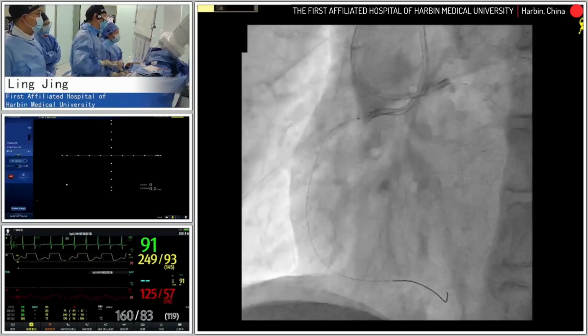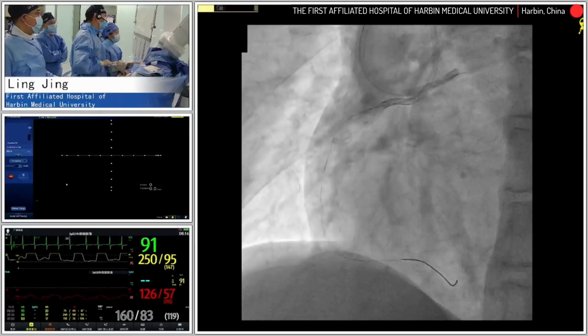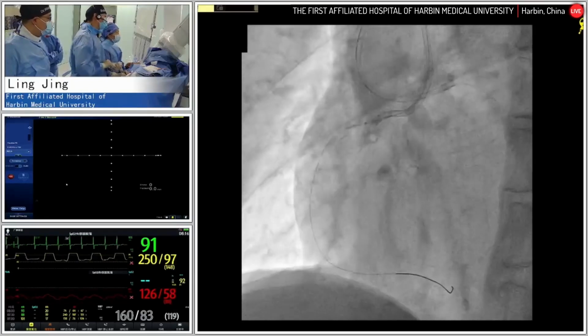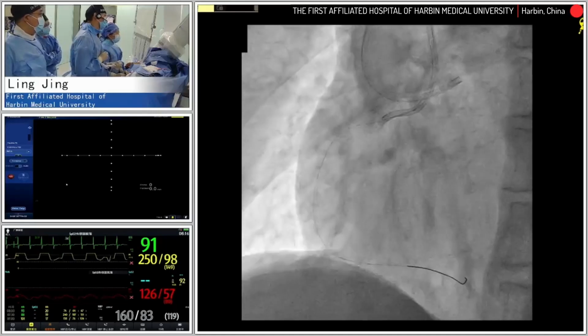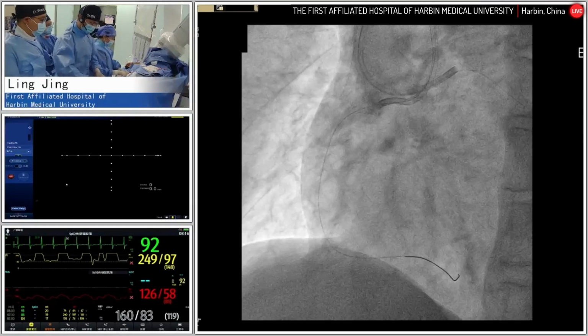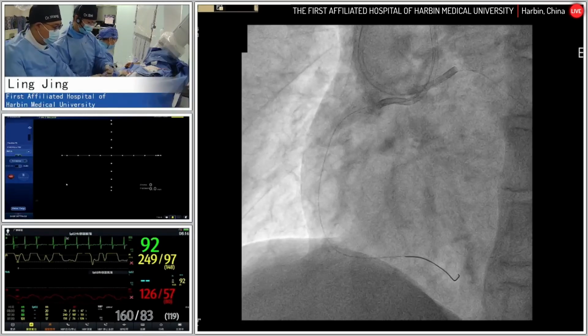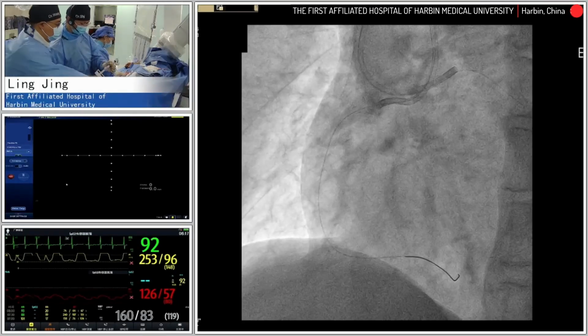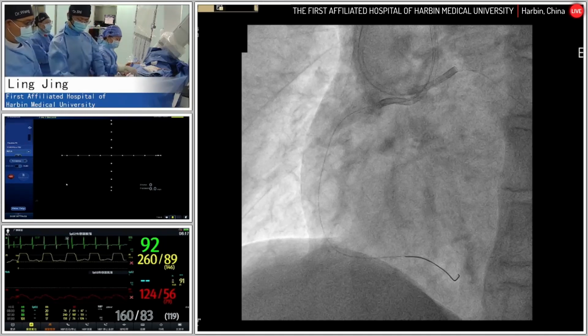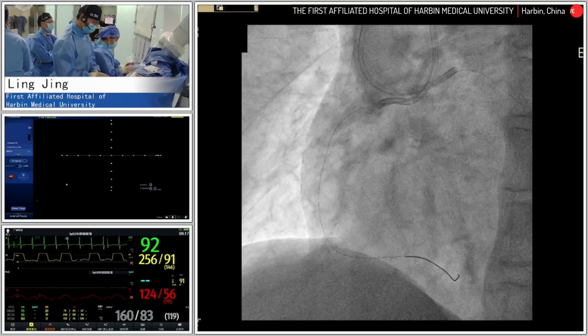However, there is a potential high risk of penetrating into the subintimal space, especially at segments with diffuse thick calcification. And for this patient, from the angiography and also the CT angiography, we noticed calcification at the most severely occluded segment.